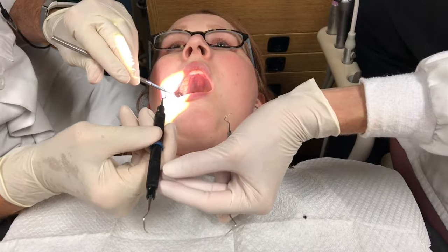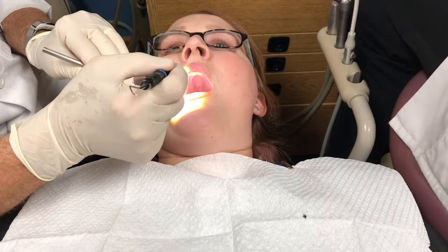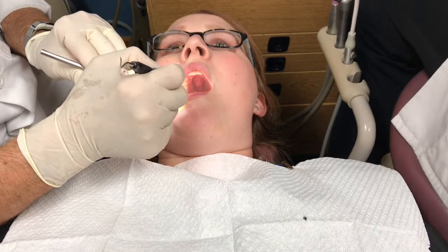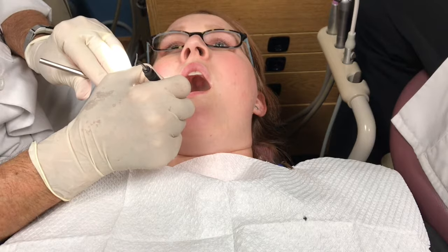Position the new instrument firmly into the operator's fingers. When placing the instrument, make sure the working end is positioned correctly for the specific arch. Place the used instrument back on the tray setup in its correct position of use.